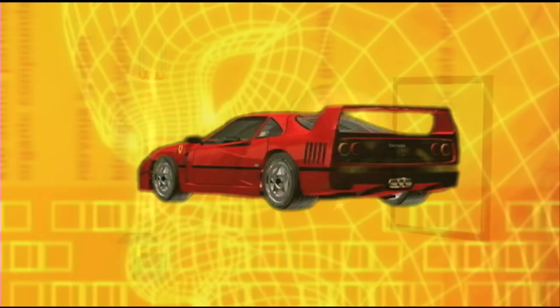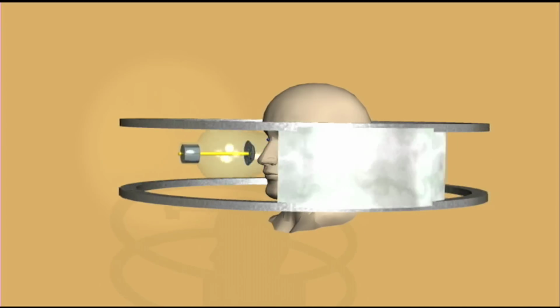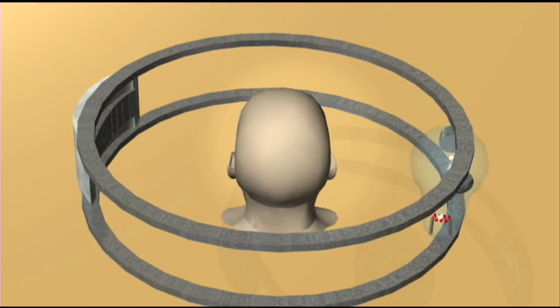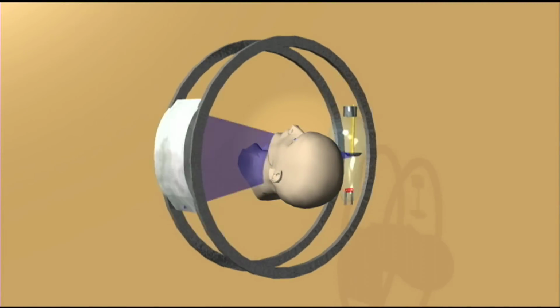The same is true for CT scanning. The more projections you take around the body, the more information you're going to have about the object you're taking images through. The advantages of X-rays, of course, is that they actually pass through the body. So not only do you get surface information, you're also going to get information about the contents of the body itself.